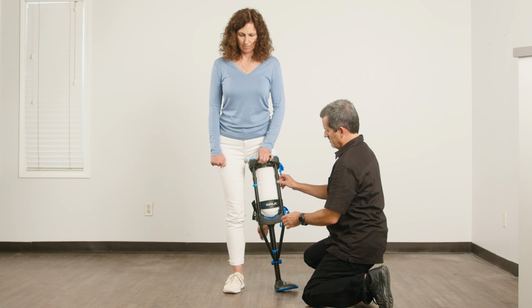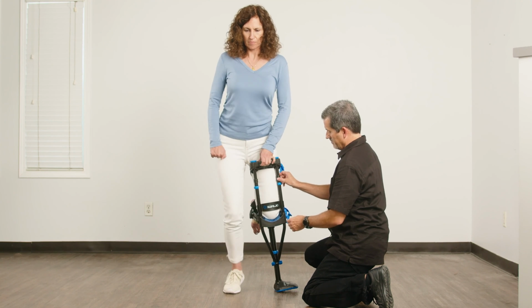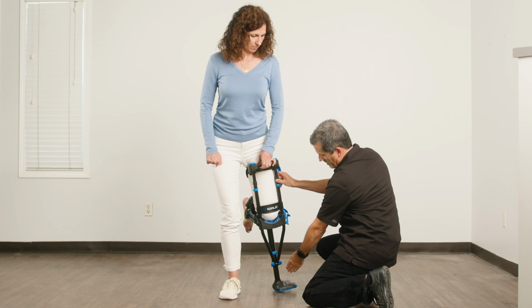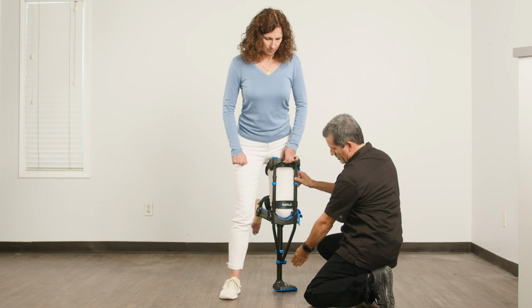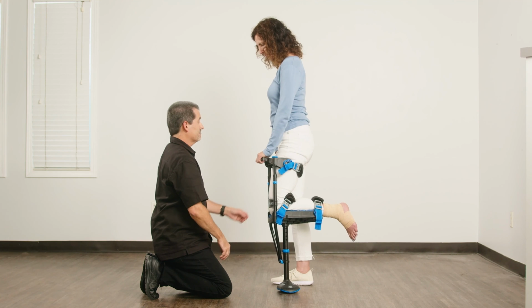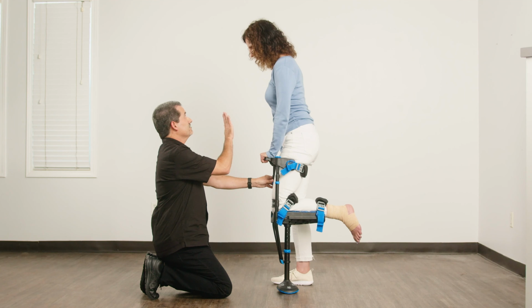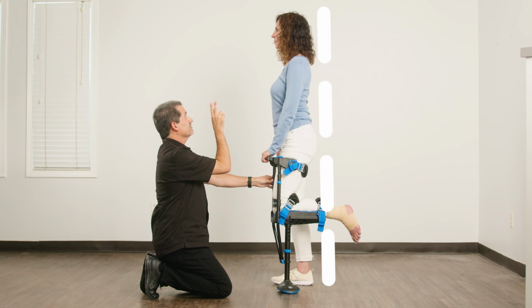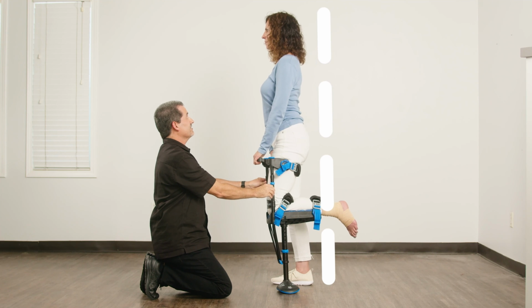Common issues. Here's some common things to look for. Most patients will gradually shift their weight back to their good leg before they take a step. It's essential that all of their weight transitions to the iWALK leg before they take a step with their good leg. Looking down: in normal walking, the head is in column with the body. It's perfectly normal for your patient to look down. Every patient will do this, but this causes postural changes that make it more difficult for your patient to learn.